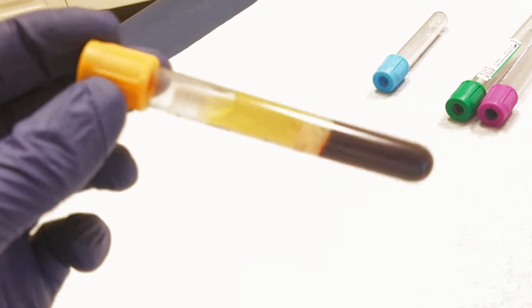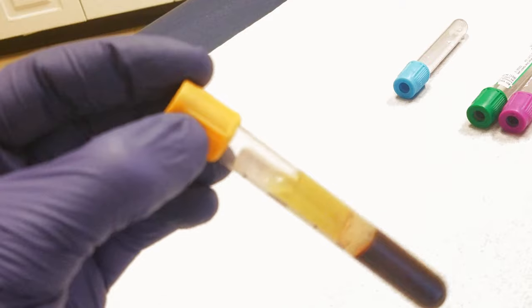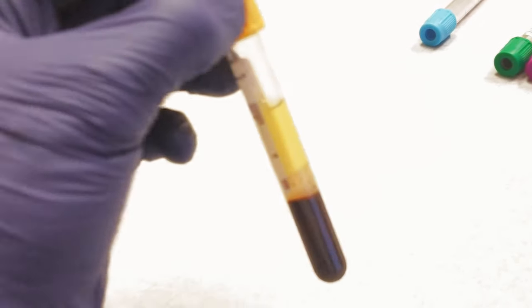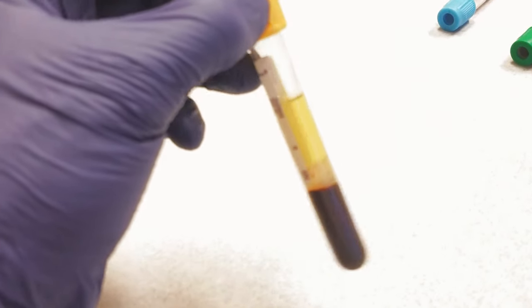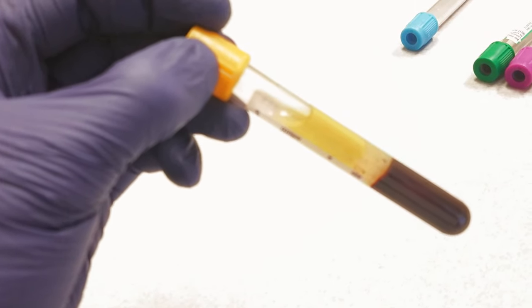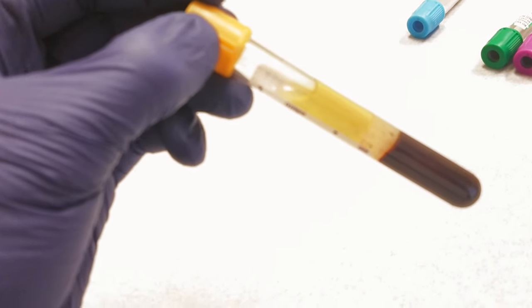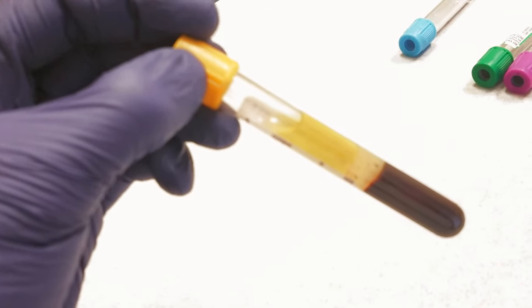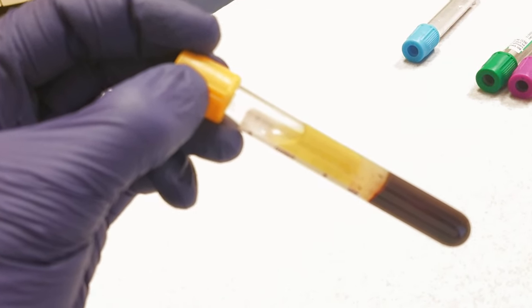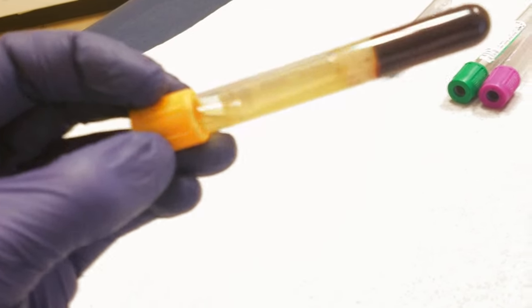We allow the blood to clot, put it in the centrifuge, spin it, and then they separate. Here is an example of one we've already done that with: the serum is now the yellowish liquid at the top, the gel is still in the middle, and the blood cells are at the bottom. Now the lab will take off just the serum and do serum tests like liver enzyme tests, creatinine, glucose, electrolytes, or antibody tests — like mono antibodies or HIV antibodies.